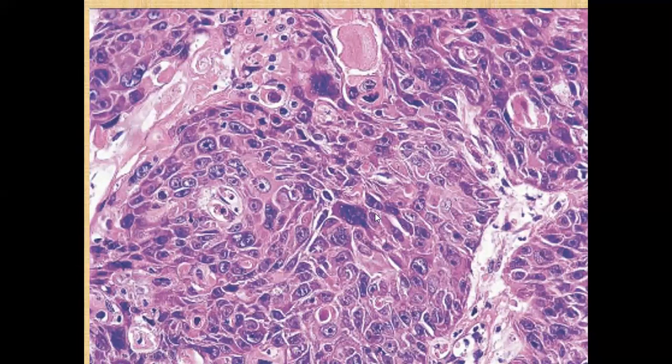This is a poorly differentiated SCC. You can see the structural atypia, lots of atypical cells, and lots of mitoses within these. But even most of the atypical cells are maintaining the desmosomal connections with the surrounding keratinocytes.